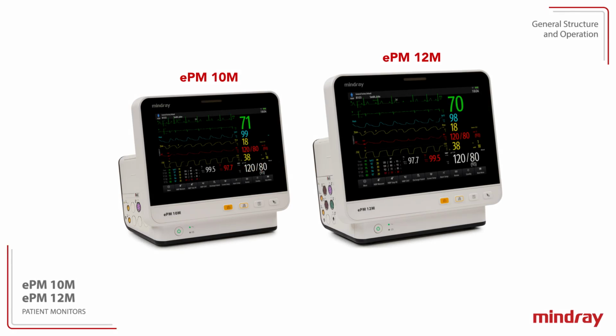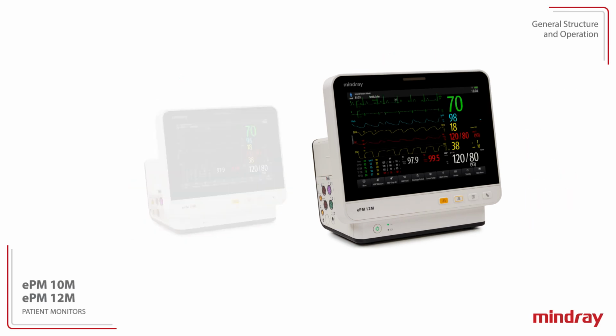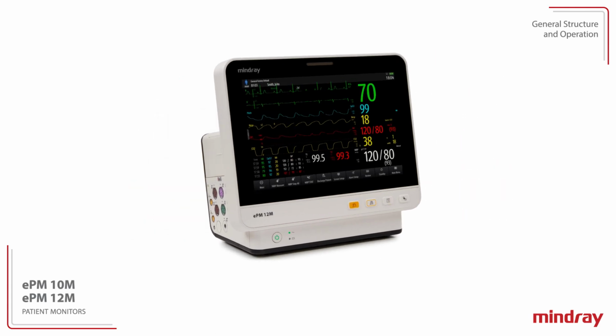The ePM 10M and 12M patient monitors enable continuous monitoring of physiological parameters, including cardiac rhythm, heart rate, respirations, oxygen saturation, temperature, non-invasive blood pressure, and capnography for low to mid-acuity areas. In addition, the ePM 12M patient monitor allows monitoring of anesthetic gas.